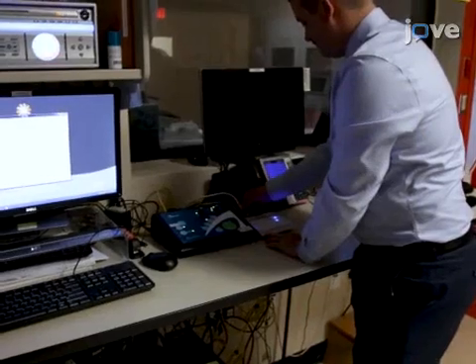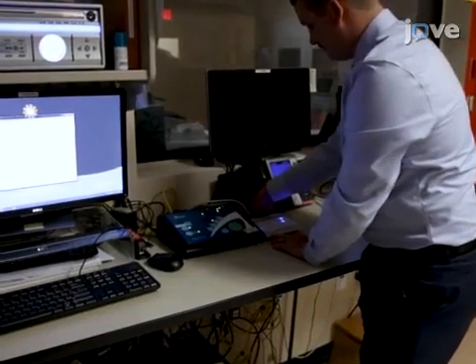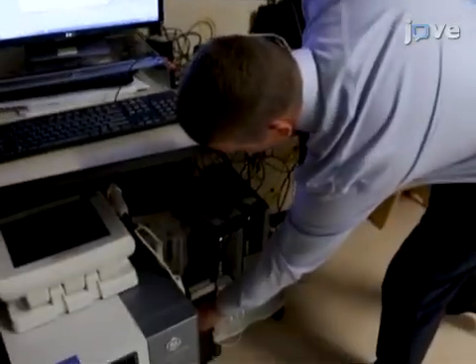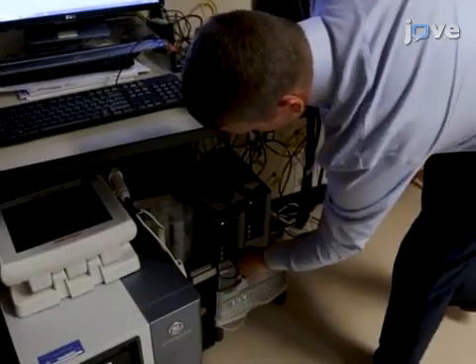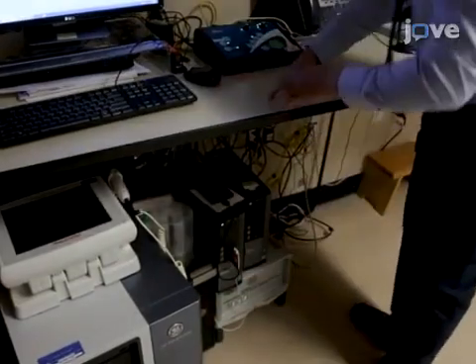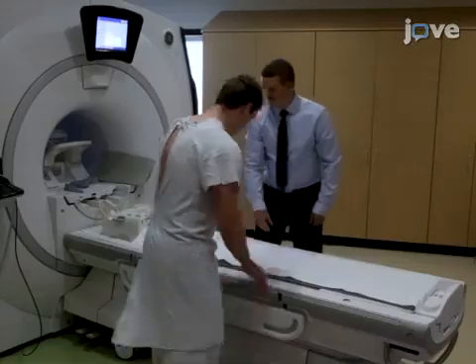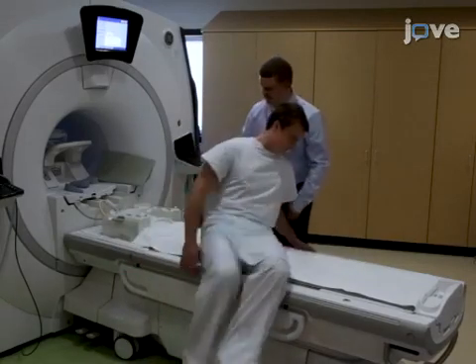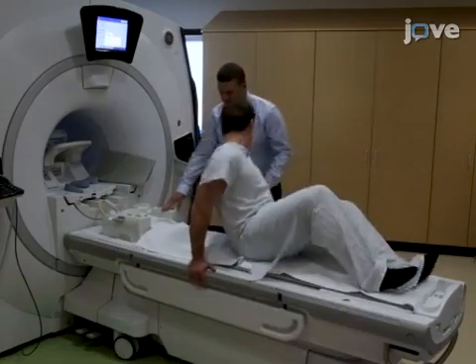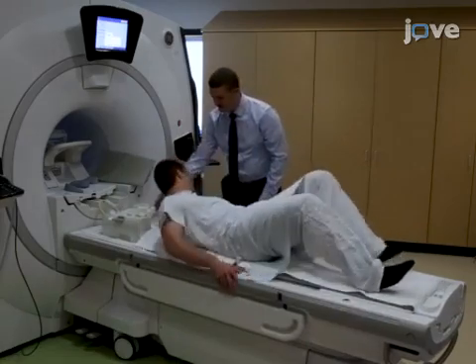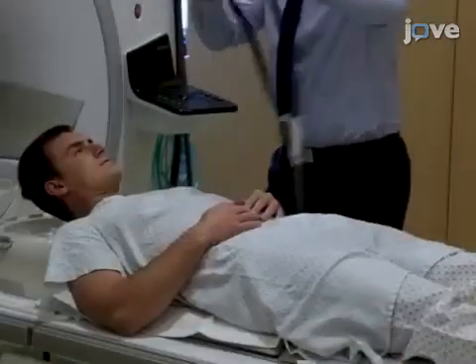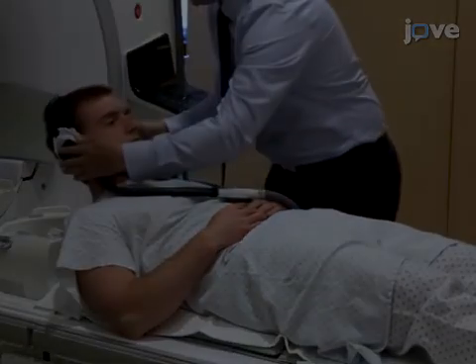Begin by connecting the TR trigger output from the MRI machine to the stimulus PC. Then position the MR compatible display so that it will be visible to the participant via the mirror affixed to the head coil. Next, have the participant lie down in a supine position on the scanner table. Place the headphones on the participant's head and ensure the ears are covered.